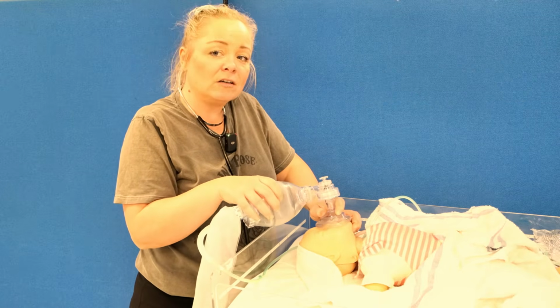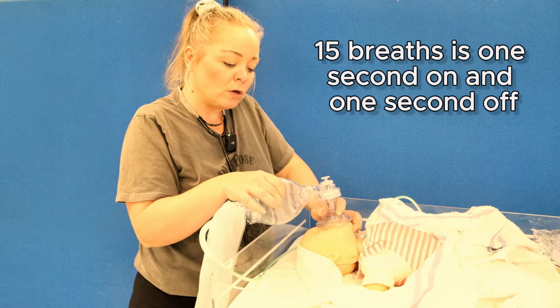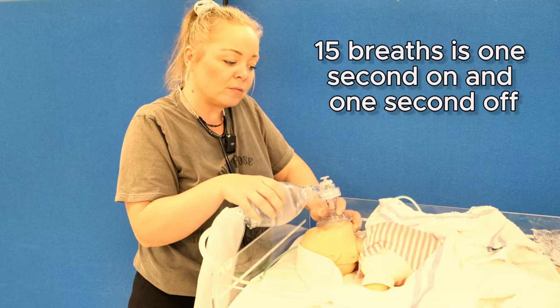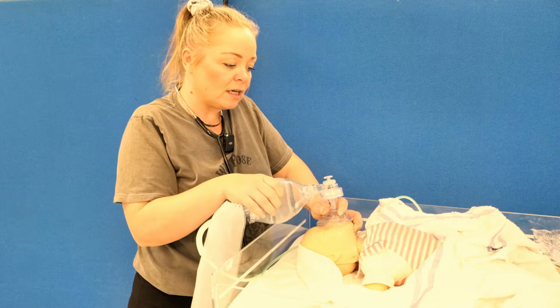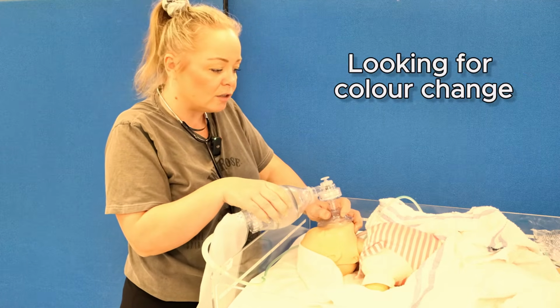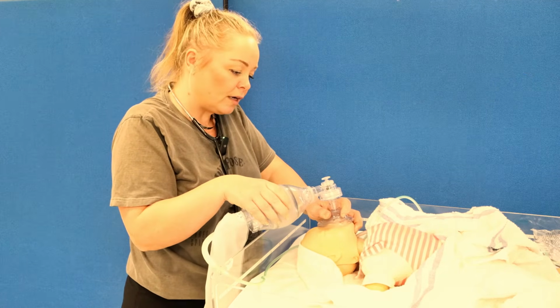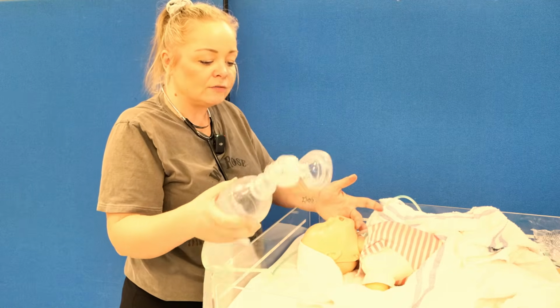If you forget to count, it's 30 seconds in total. 15 breaths is 1 second on and 1 second off. So by the time you've got to 30 seconds, that will be your 15 breaths. 10, 11, looking for chest rise, looking for colour change, looking for any movement the whole time. 14 and 15. I've done an intervention.